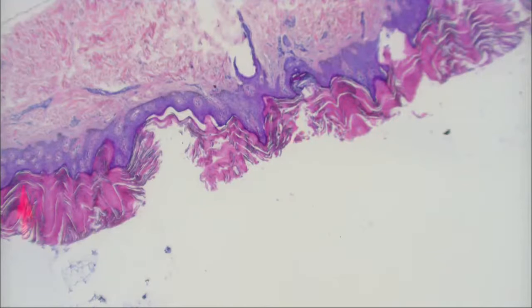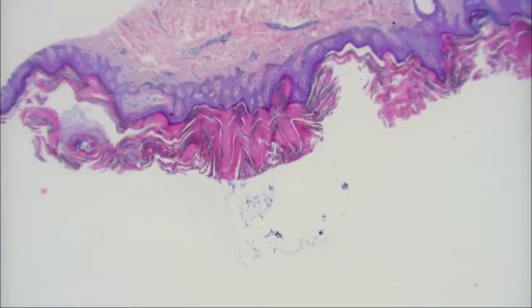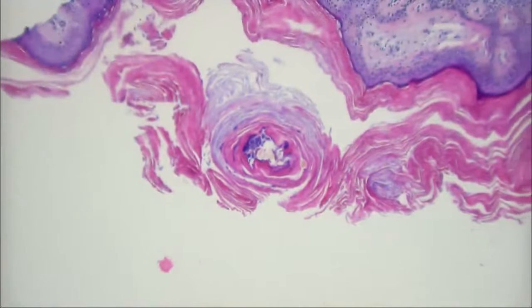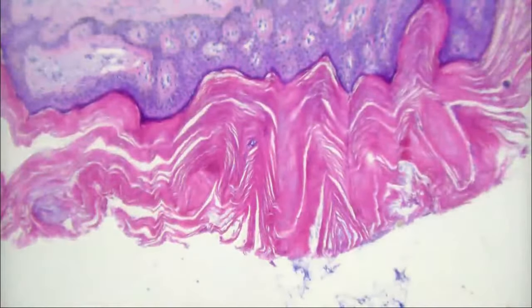And this is more digitated, and notice it's got reticulated epidermal hyperplasia with overlying digitation. So yeah, this could be a seborrheic keratosis. But you were saying the cornified layer is a little bit unusual for that. Yeah, I thought that was where I noticed the majority of the changes. There isn't any parakeratosis, but there's definitely orthokeratosis. Yeah, I agree. This is not a normal cornified layer. It's thickened, and I thought there were little collections within it. Yeah, there probably are some pityrosporum in here, right here, for example.